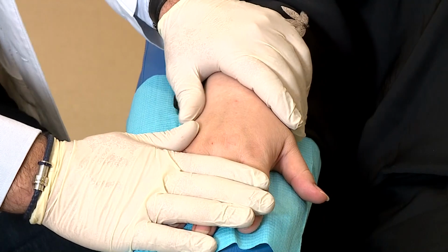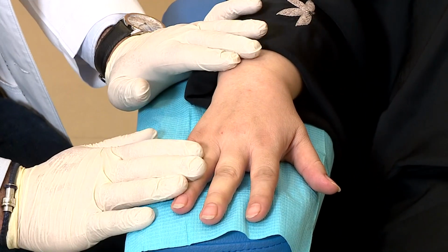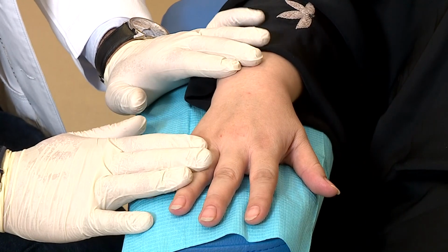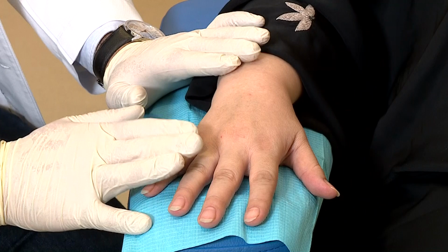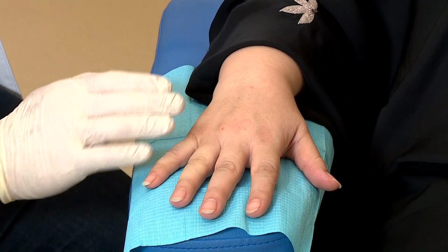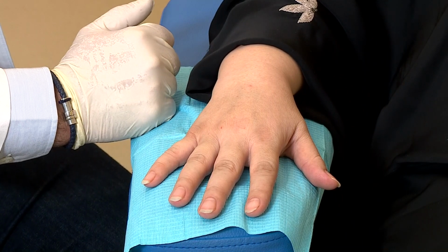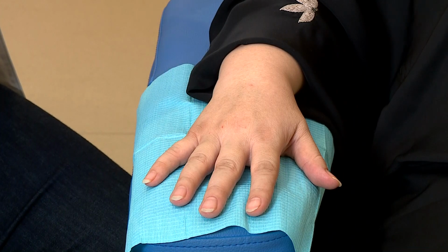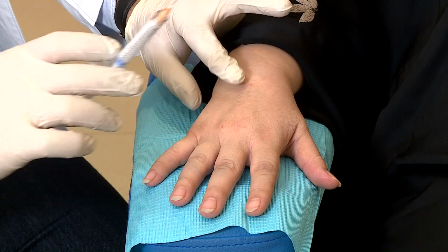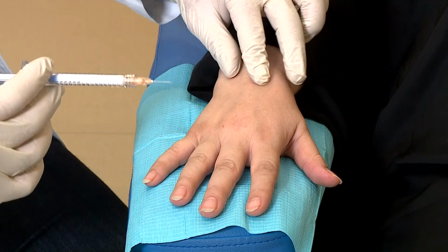Okay, now we will inject the other hand using a little bit of a different technique, using the sharp needle instead of the cannula, just to show that actually this procedure, whether you're doing it with a sharp needle or with a blunt cannula, is both an easy and accessible technique to do. The pain and the risk of bruises will be a little bit higher using the sharp needle compared to the cannula, but at the end of the day, the outcome is the same. It depends on your comfort.